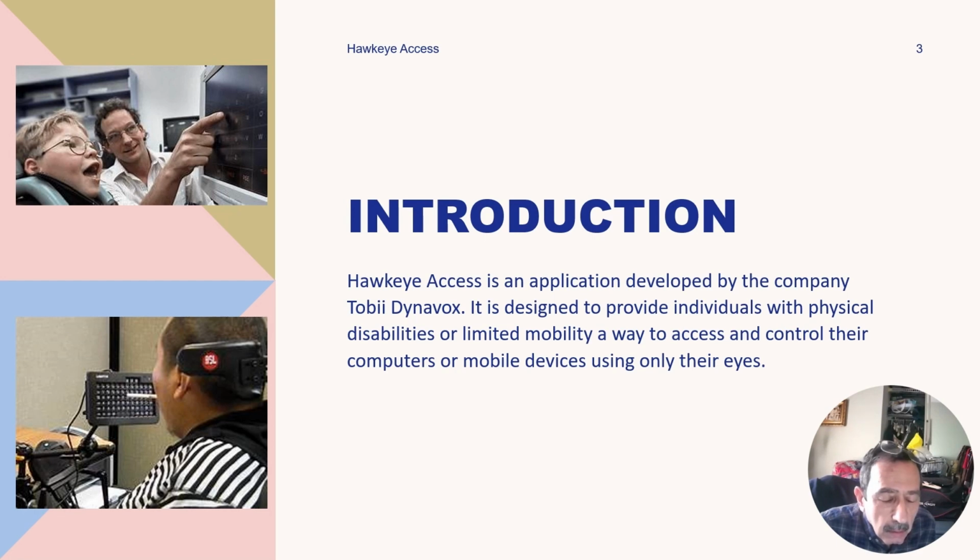This will make them overcome their disability or their limited movement, and they can just control the screen without using their hands or even the mouse.